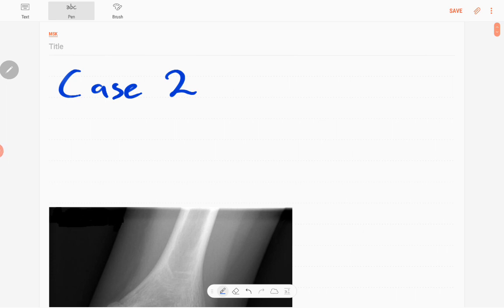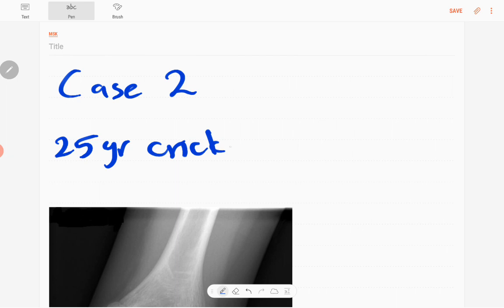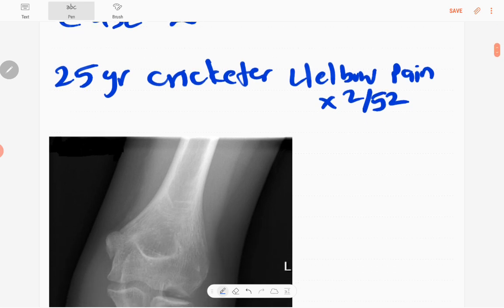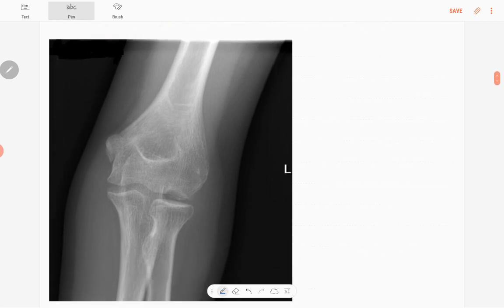Welcome back everyone. This is case number two of the MSK series. This is a 25-year-old patient, actually a cricketer, who presented with left elbow pain for two weeks duration. This is the X-ray.